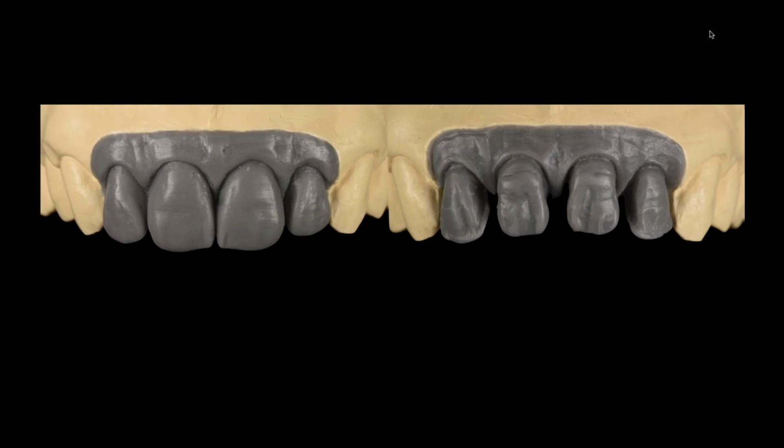So you see the diagnostic approach of my buildup of wax, and then you see the cutback. What was interesting about this case was I cut it back in two different ways on purpose. The laterals are going to be micro-layered. And I want to micro-layer them because I do a lot of that today, and I think our profession is doing a lot of that.